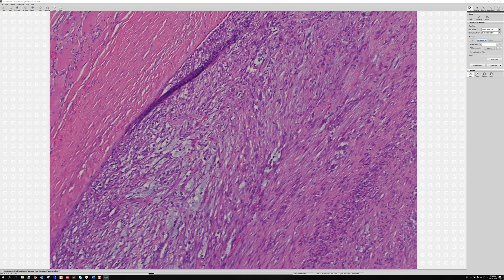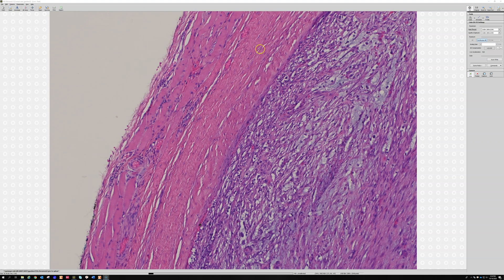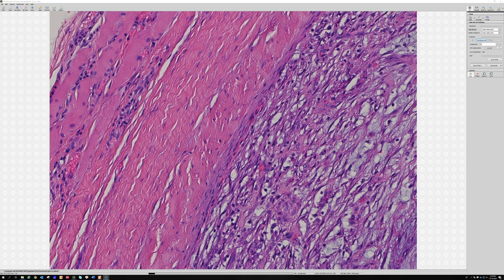Nodular fasciitis arises from the fascia - hence the name. The 'itis' makes people think there should be a lot of inflammation, but usually there is not. You might find scattered lymphocytes and histiocytes, but it is not a highly inflammatory lesion despite the name. Looking at the fascia here: spindle cells with dense pink collagen in bundles is either dense regular connective tissue - tendon, fascia, or ligaments - smooth muscle, or nerve. The ultra-wavy collagen bundles we see here are characteristic of fascia or tendon.